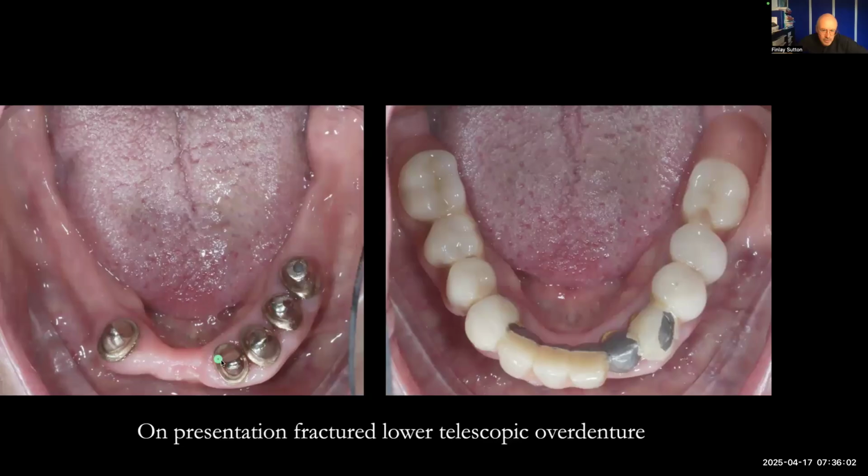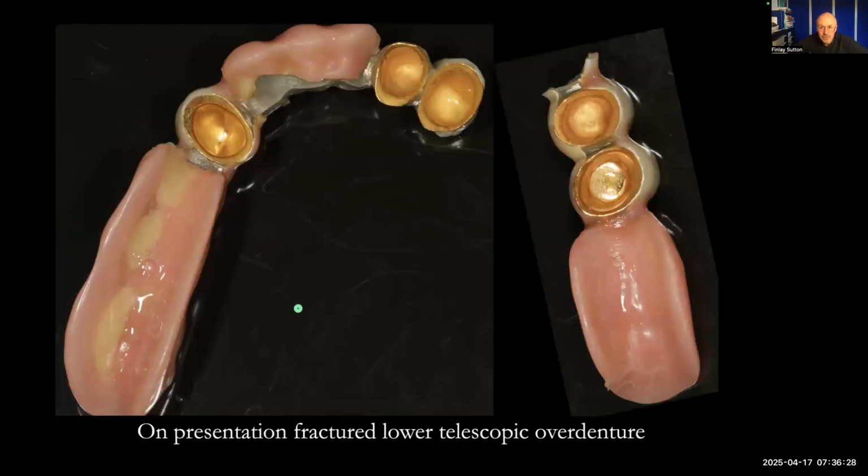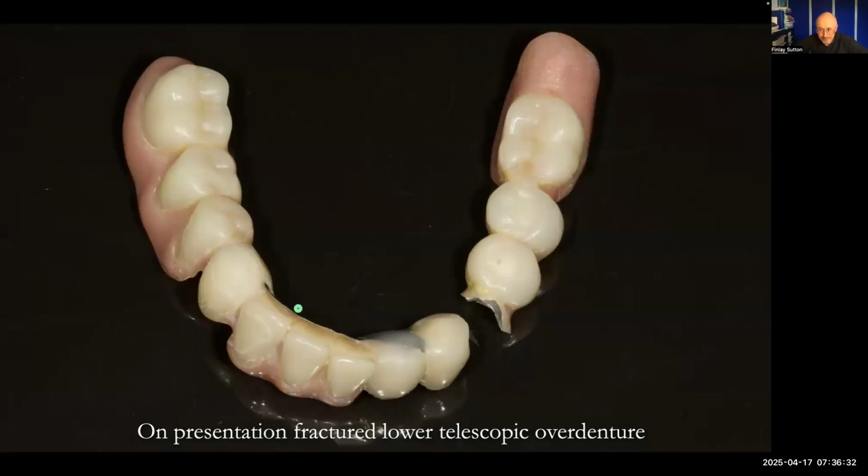We've got these telescopic gold crowns. That's been root filled. You can see that through the top of that. And that's an issue with these sorts of things because they do have to be prepped quite heavily to the teeth. And quite often we know that, with crowns, at least 25% of them devitalize. So it's a common issue. And this is the lower fractured overdenture there.